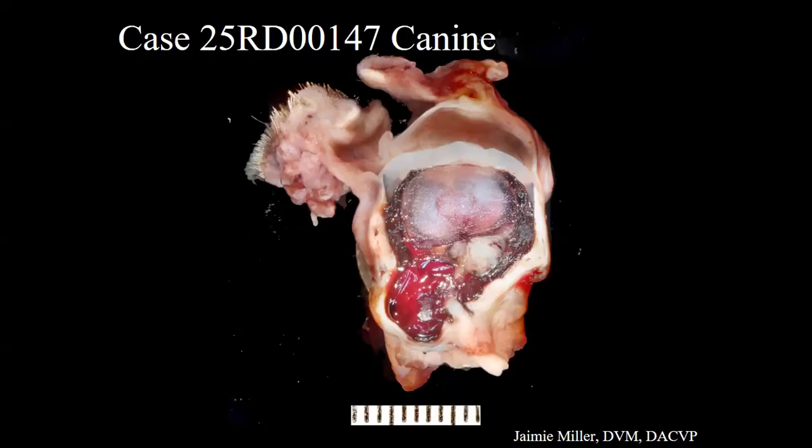We can have some clues because one of the reasons that we sometimes will leave the extraocular tissues on is that sometimes they get adhered to the globe because of fibrosis around where the puncture site may be. So if there's a place that we think might be suspicious for a site, we'll definitely try to sample it in. Most of the time we're kind of cutting a little blind and hoping for the best with our sections.